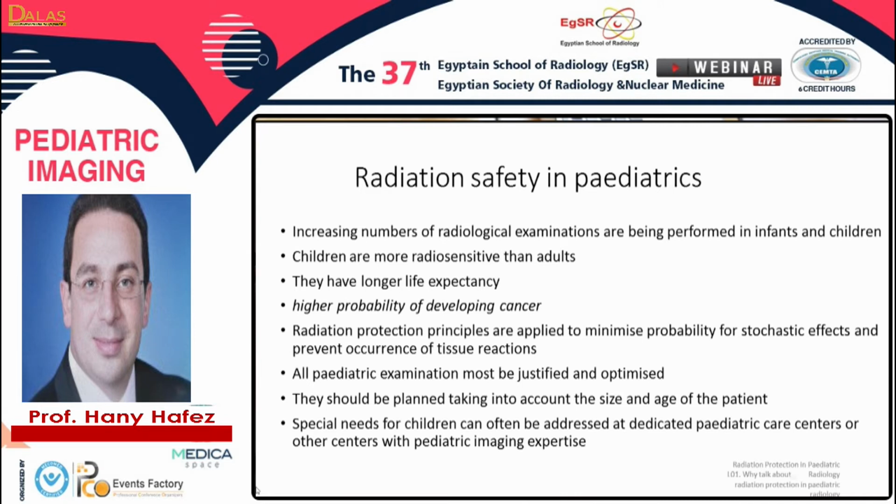Pediatric patients have a special character of radiation safety. An increasing number of radiation examinations are being performed in infants. Children are more radiosensitive than adults. They have a longer life expectancy and a higher probability of developing cancer.